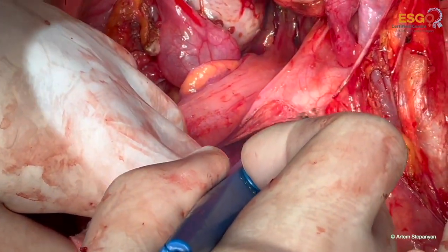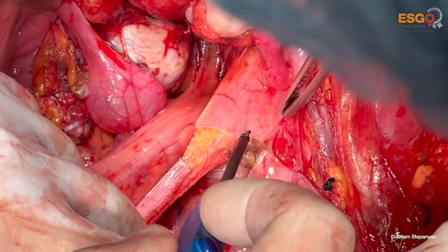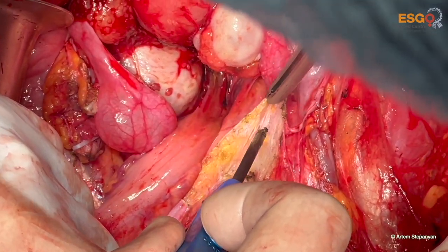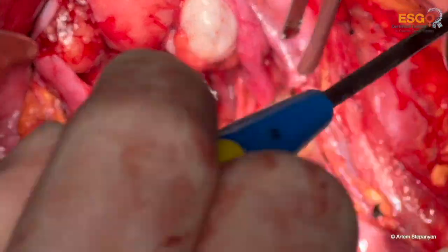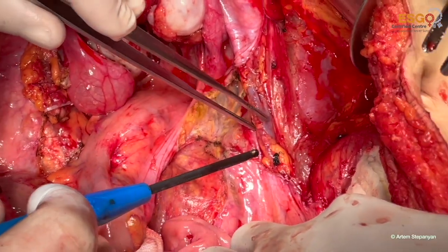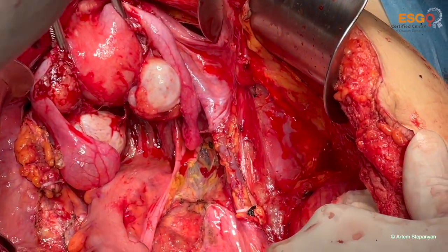Here we see the peritoneum of the posterior pelvis, located on the right of the rectosigmoid. We detach it again, keeping an eye over the right ureter. And once the ovarian vessels are visualized, we also visualize the ureter. And now the ovarian vessels can be clipped and divided.